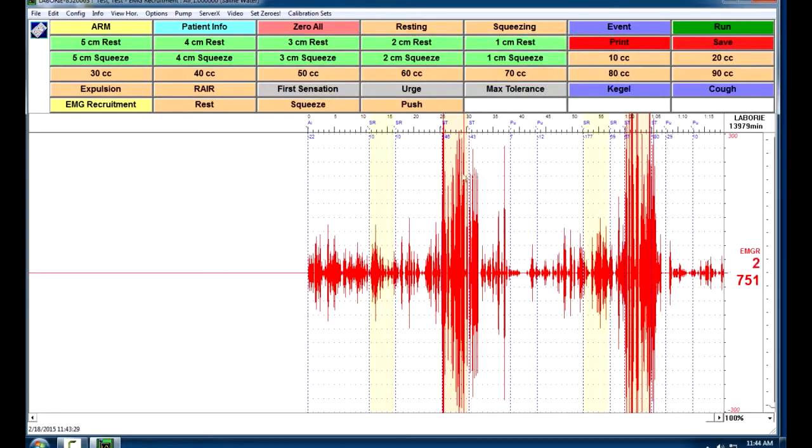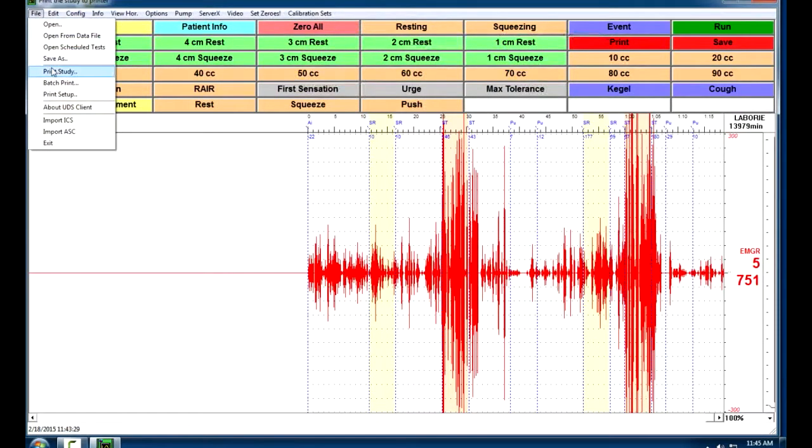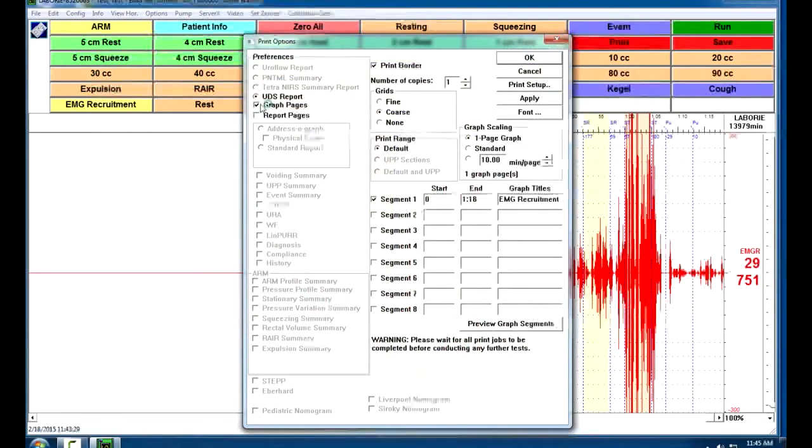At this point, it's a good idea just to go ahead and print it off. All we're looking for are the graphs. We don't have any actual numbers that we're looking for. So the easiest way to print this is to go up here to File, Print Study, and we're going to do a UDS report, even though we're just measuring the EMG, and all we're interested in is the graph pages. Nothing else needs to be checked. We want one page graph, and then we click OK.